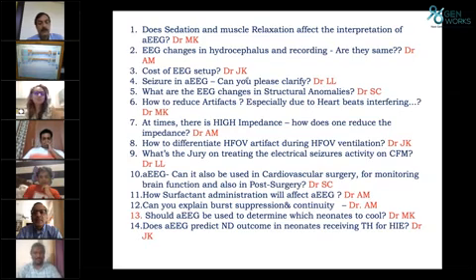Okay. And then there's the cost of the electrodes as well, right? Yeah. The recurring cost of electrode, that needle electrode costs around 500 to 700 per patient. Then hydrogel is same. No, actually that needle electrode is much more. It is maybe 1100 per piece, and that hydrogel is around maybe 750 rupees. Okay, so there is a recurring cost also there.